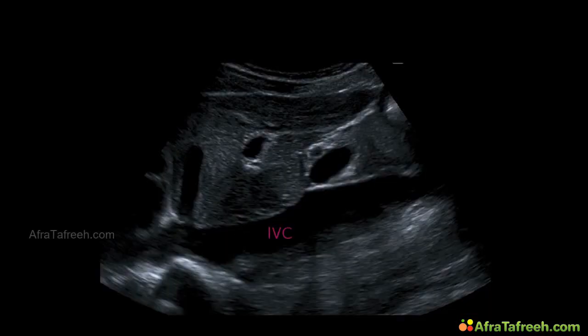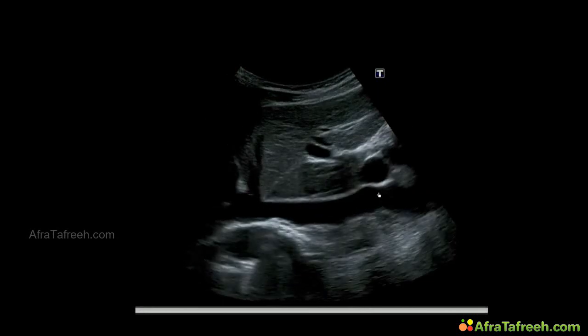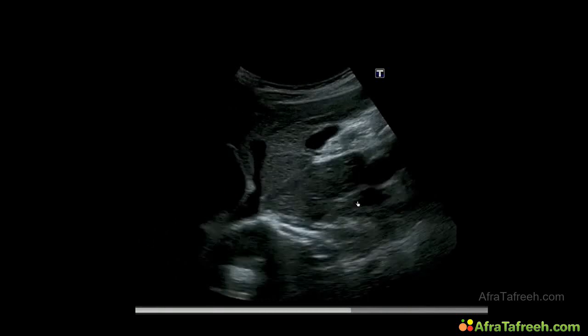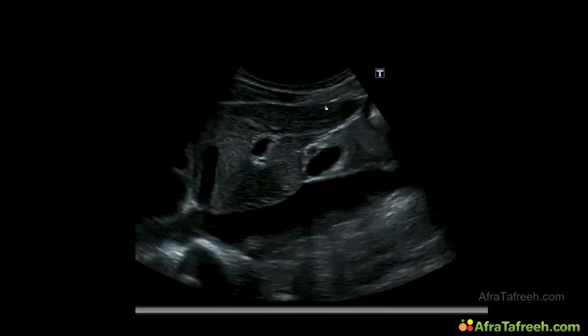We see the IVC on our ultrasound screen over here in a longitudinal direction, anterior to the spine and dorsal to the left liver lobe over here. We go on for the video clip, and now you can easily see the motion of this vessel is double pulse. Once again, a pulsating, tubular, echo-free structure, posterior to the left liver lobe and anterior to the spine.